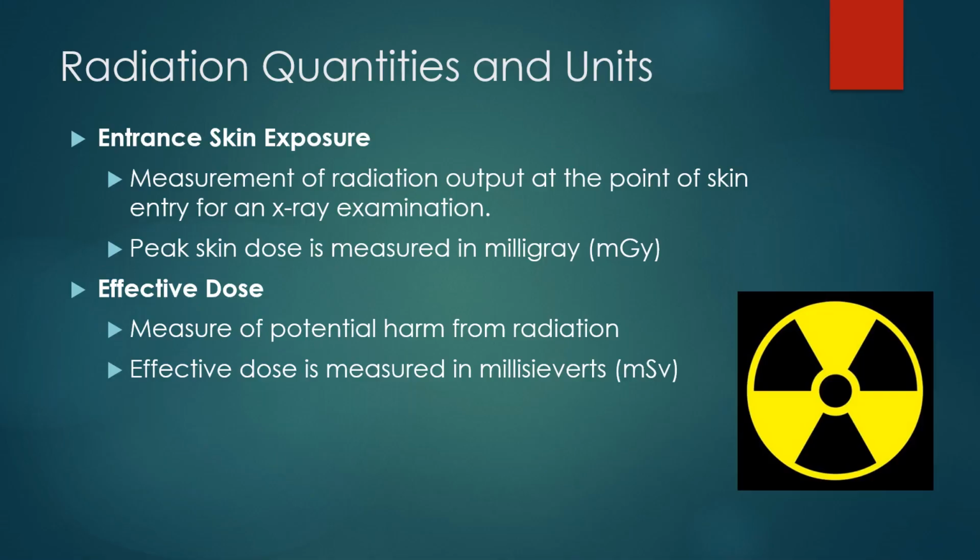Entrance skin exposure is the measurement of radiation output at the point of skin entry for an X-ray examination. Peak skin dose is reported in gray or milligray. Effective dose is the measure of the potential harm from radiation and is reported in sieverts or millisieverts.